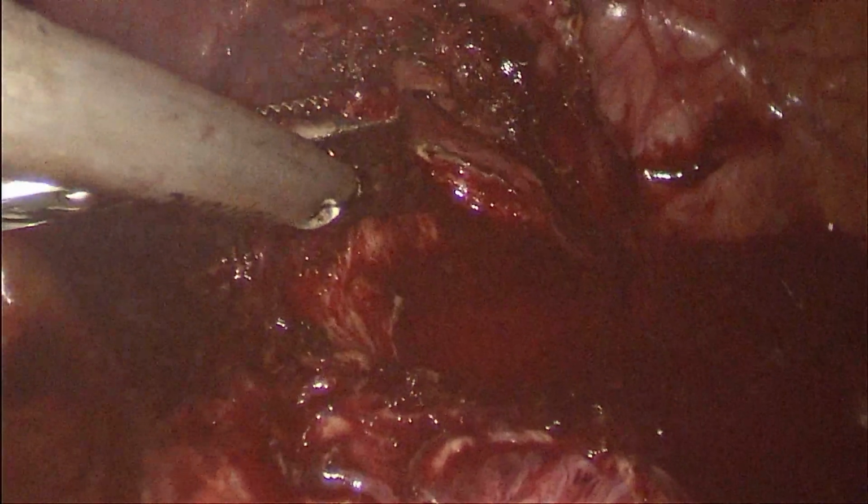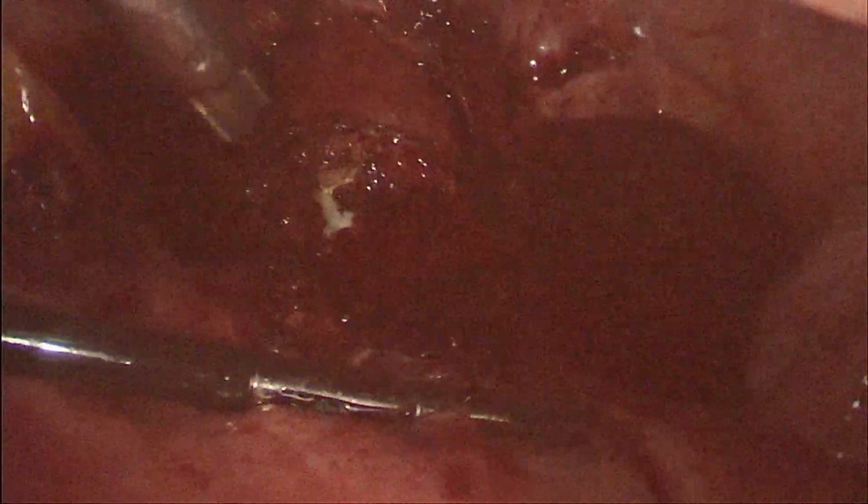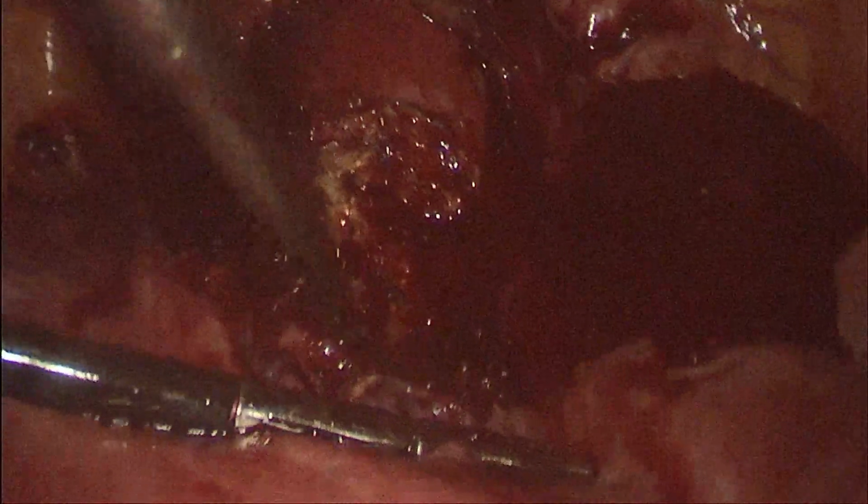So all around, the fibrous tissue is excised. So that was the site where the pregnancy was.